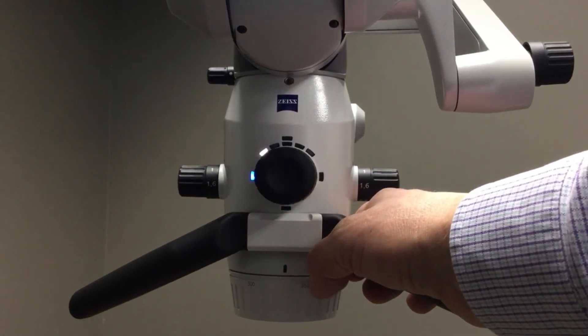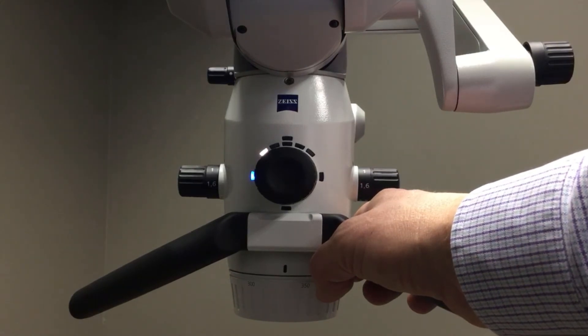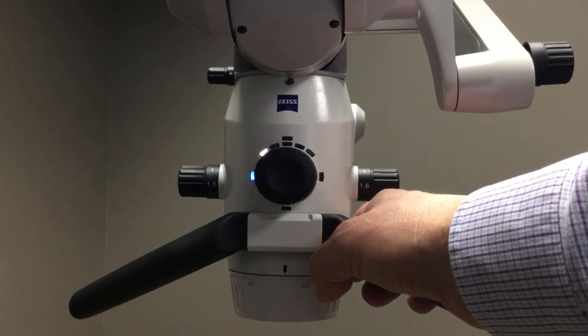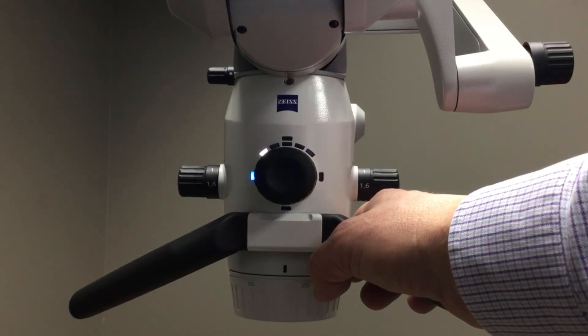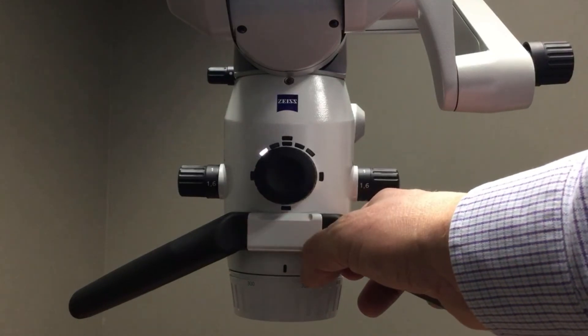If I tap the wheel in the nine o'clock position, that is going to be my blood filter. The filter will turn into a greenish color light, and that will make differentiating blood and soft tissue much easier for the operator in a surgical procedure.